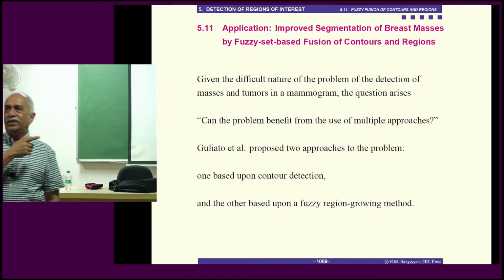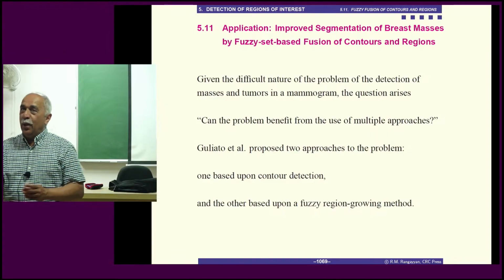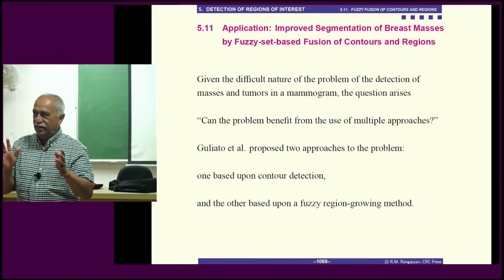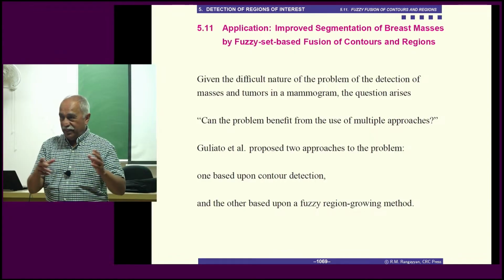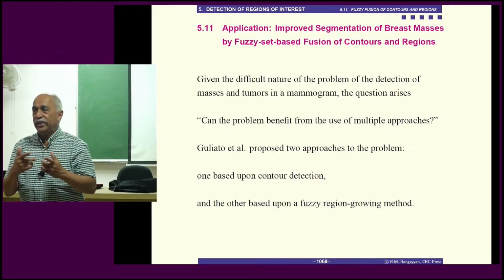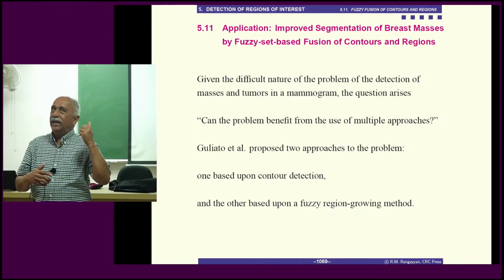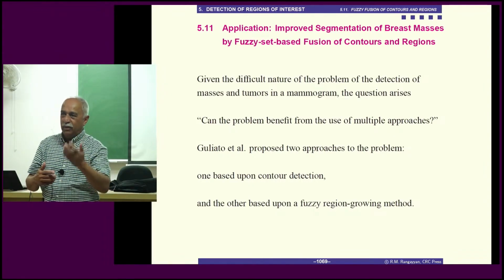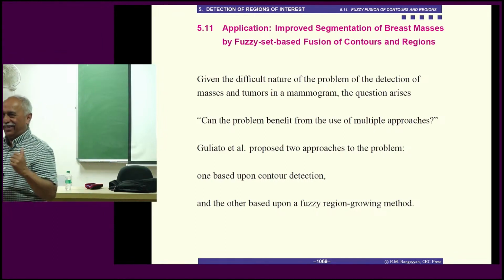Other filters were used, for example, low pass filtering to remove noise and so on. But it depends on what you want to detect. Certainly, there is nothing preventing one from applying multiple different types of filters, getting their outputs and combining them. But it depends on what you want to do. In this case, we want to only detect edges, and Gabor filters, being bandpass filters, will detect edges. As I said, you don't need Gabor filters in this case.